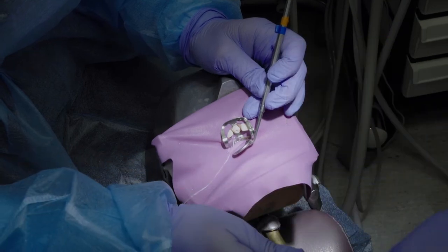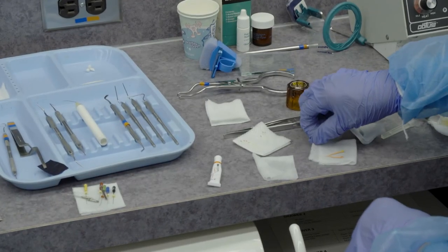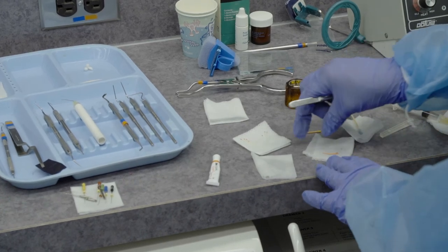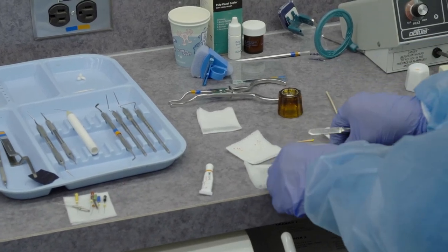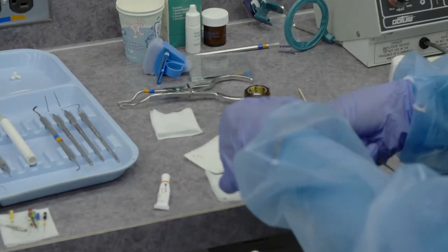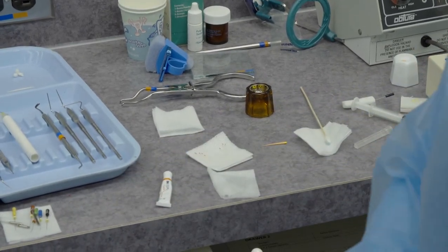The dentist will then tell the assistant what size guttapercha we are to try in. Size 25. The assistant will pass the guttapercha on a wet 2x2 and the locking pliers to the dentist to try in.